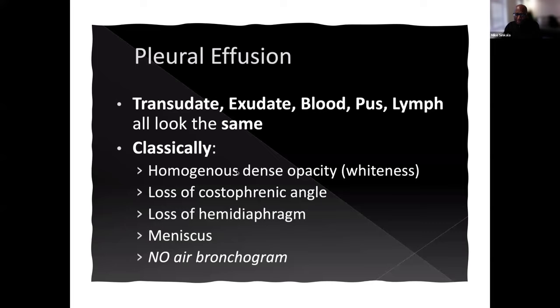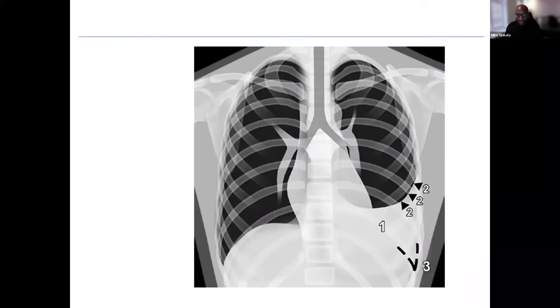For those that missed the first part, I explained what a bronchogram looks like. This is the classic example of a pleural effusion. We have obscuration of the left costophrenic angle and a complete white out of the lower lung zone on the left side. Notice the homogeneous, increased density on the left, and a meniscus, which is quite classic in a pleural effusion.